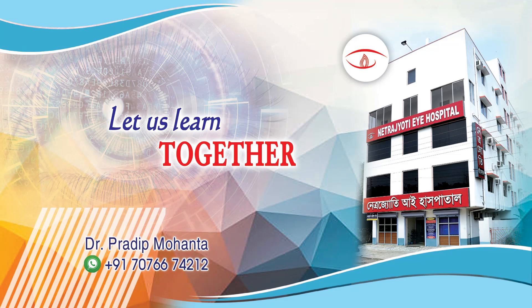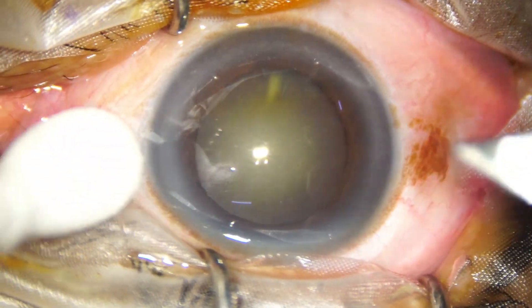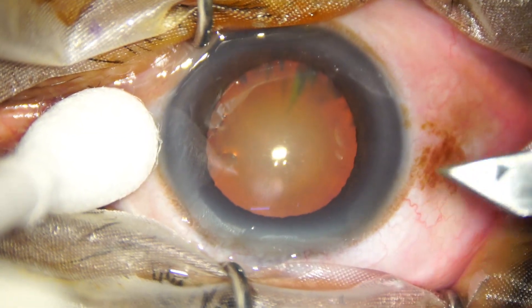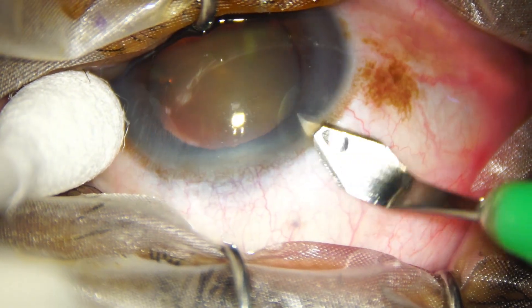Welcome to my workplace at Rana Gha, West Bengal, India. Let us observe this surgery. This is a cataract with grade 3 nucleosclerosis. There is some floppiness of the iris in this case.